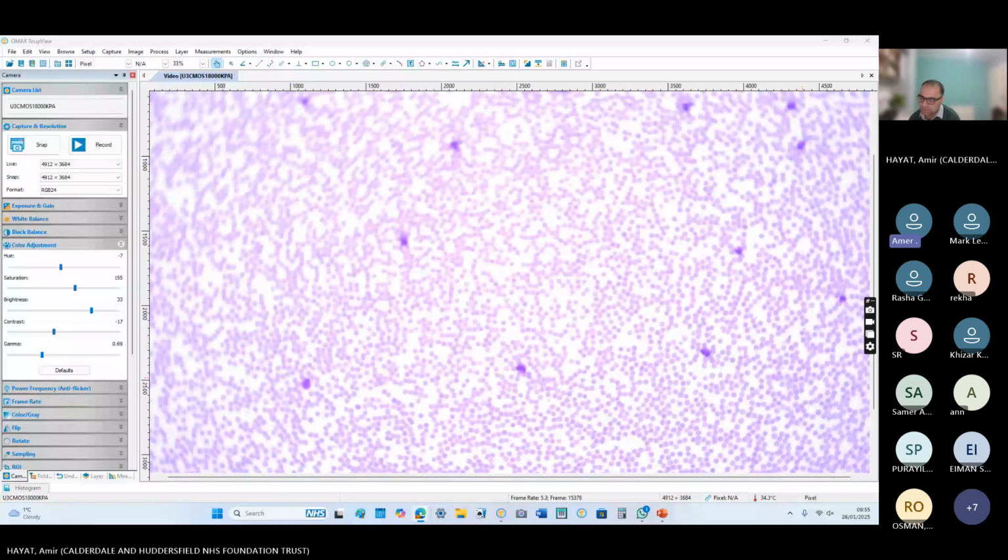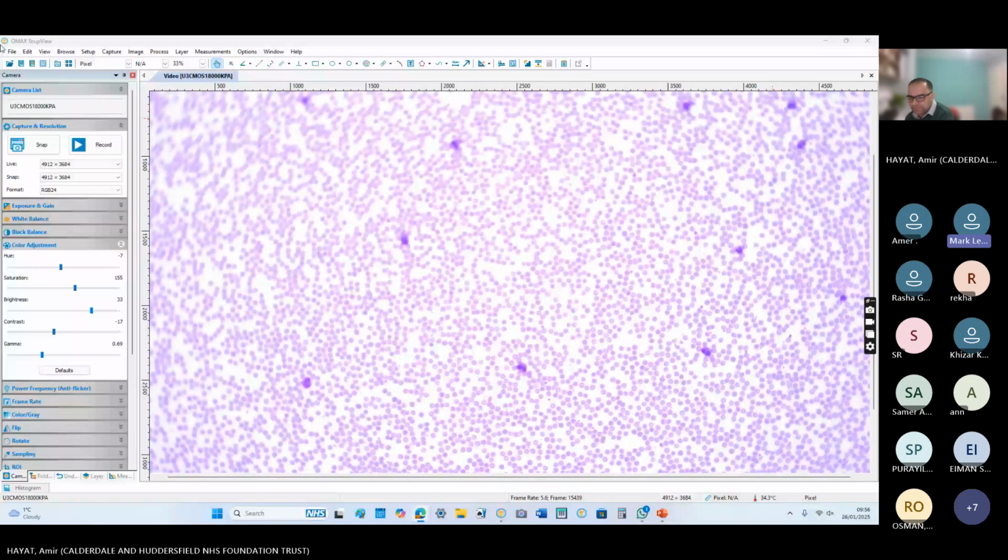And if you could not find a worm, then you will go for other causes of eosinophilia. Have you got a travel history on this patient? This was the point that you snatched from my mouth. I was about to say it. If the scenario says that this patient has traveled to African countries or South American countries, then certainly there is a worm, but you are missing it.